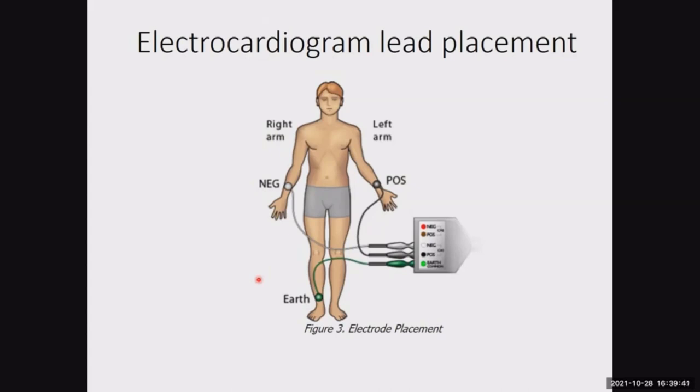Like we've seen in the past, if these electrodes are a little bit loose, or if you haven't cleaned the skin and used some electrode gel, you may not get a good connection. So you want to make sure that the leads are attached, and that you've got a good quantity of electrode gel that doesn't interfere with the ability of the electrode to stick to the skin of your subject, but still allows for the picking up and reading of these electrical signals.